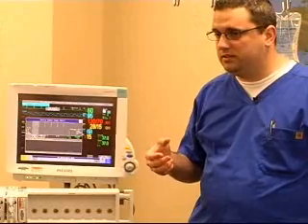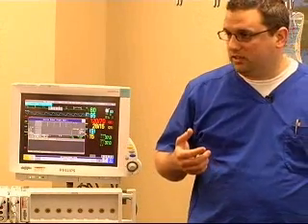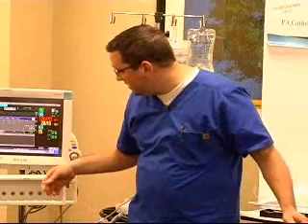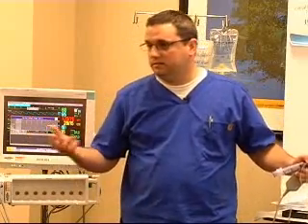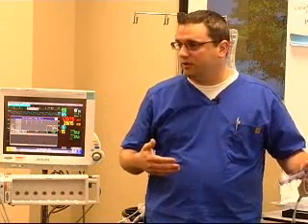Confirm your computation constant, and what that means is that we're all talking the same language, basically. The computation constant for the Paceport Swan is 0.59, or 0.592, if I can say it right. And where would we find that constant? It's actually in the package insert, and it'll tell you which one you're looking for.